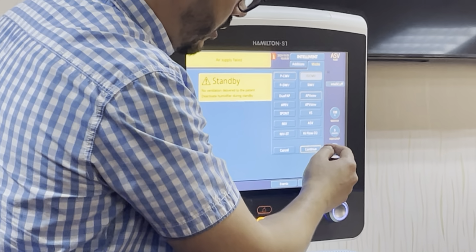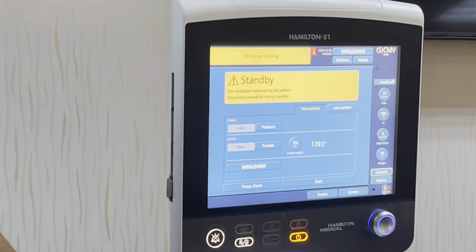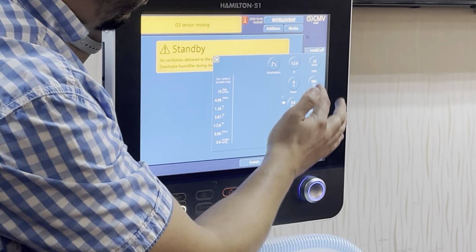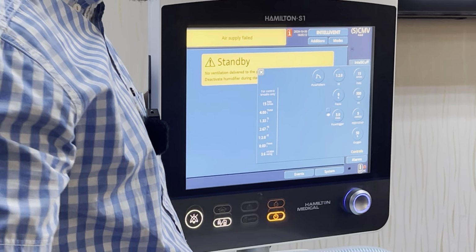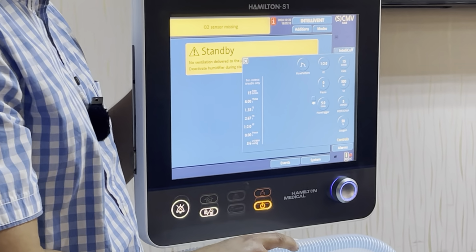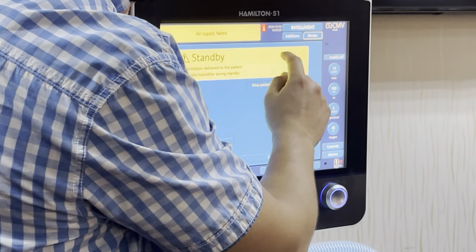Both mandatory modes are designed to ventilate a passive patient with no spontaneous breathing. So we will set the rate, the tidal volume, the PEEP, and the ratio. The patient will be ventilated mandatorily with these parameters. So every minute the patient will get 15 breaths per minute with a tidal volume of 500, PEEP of 5, and a ratio of 1 to 2. Okay? So very easy.